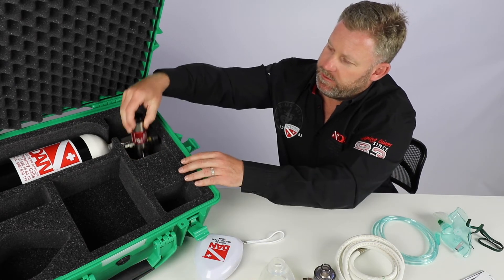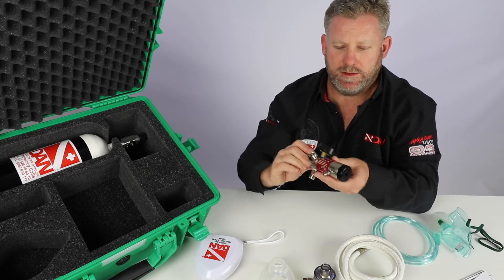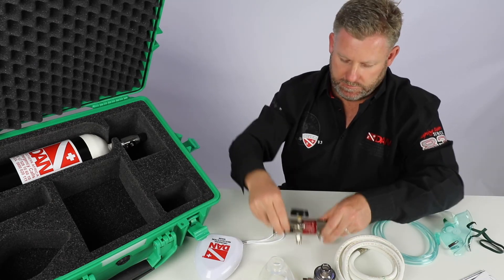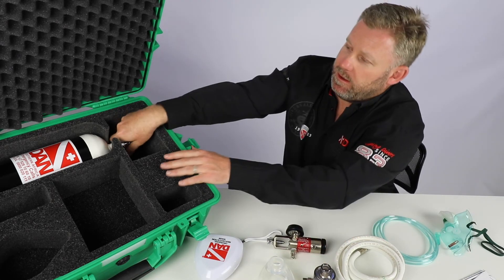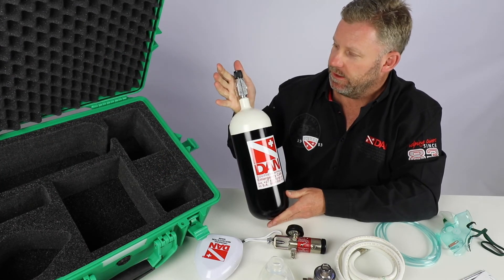Underneath here we have the pin index adapter that comes with the pressure gauge on it, as well as the other adapters for you to attach all the other goodies to. And then we have the 2.5 litre steel oxygen tank or cylinder.